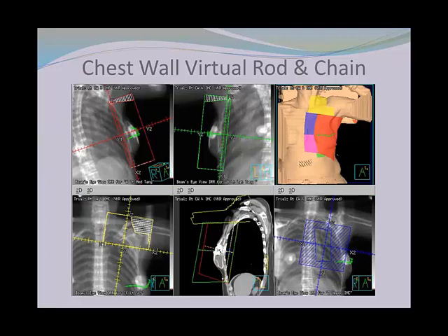Okay, so next I wanted to discuss with you about using VMAT for chest wall cases. Normally we don't do a lot of VMAT for chest wall or breast cases, only on certain cases where we can't use the normal setup we do with our chest wall cases. Then the physician might want to use VMAT for these cases, like the one I present to you. But before I present a VMAT chest wall case, there are a couple of things I just want to talk about with VMAT planning in general.